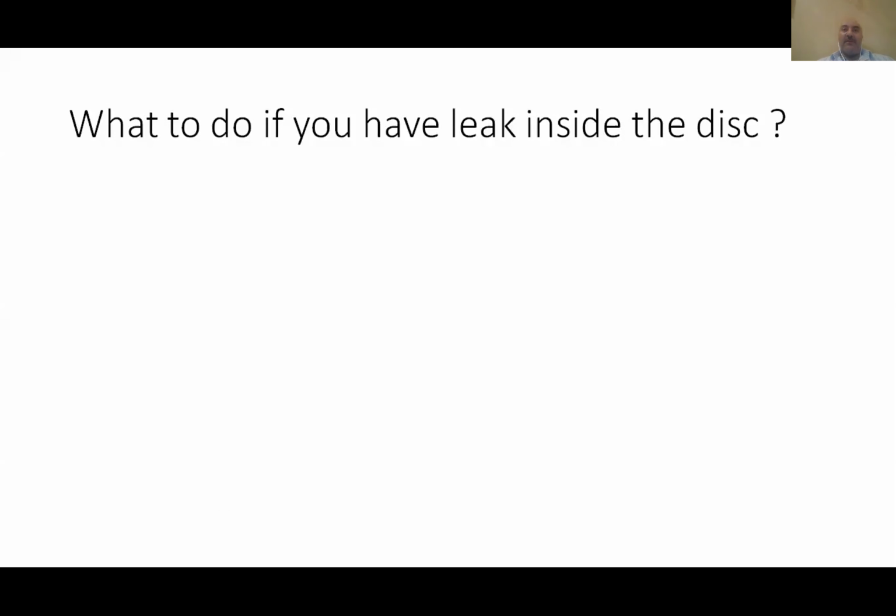So I believe if there is some leak going through that disc on one side, it is good because you're going to change that disc from a soft, fixable one to a solid one. So you're going to avoid future surgery to deal with adjacent degenerative disc disease.